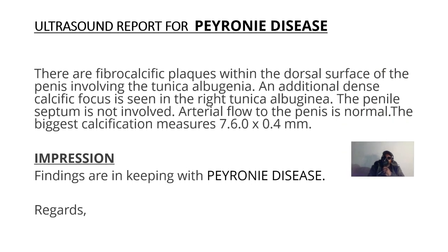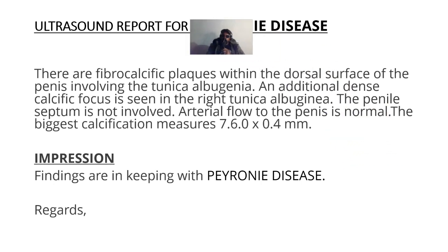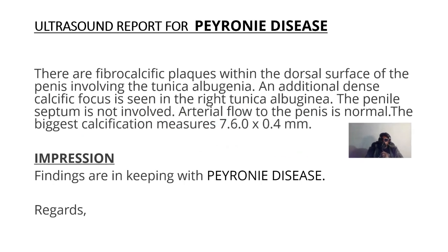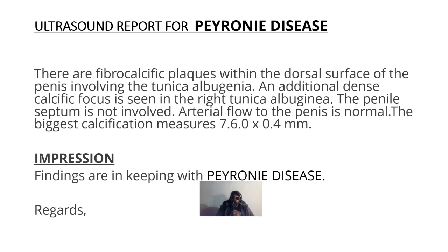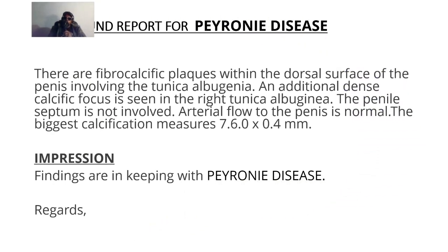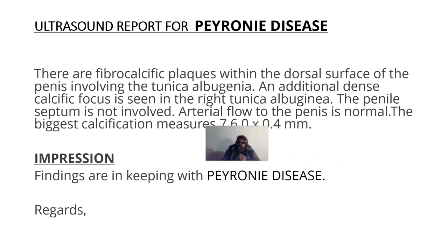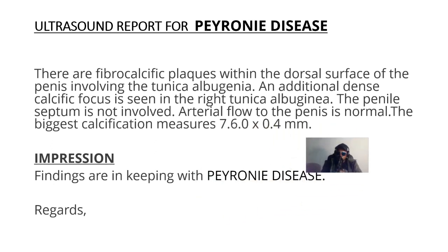So I need you to build your confidence in report writing in ultrasound. So this is the hallmark of good ultrasound practice, because if you cannot communicate your findings, it means you cannot be a good practitioner and you are not valuable in any sense to the medical fraternity.